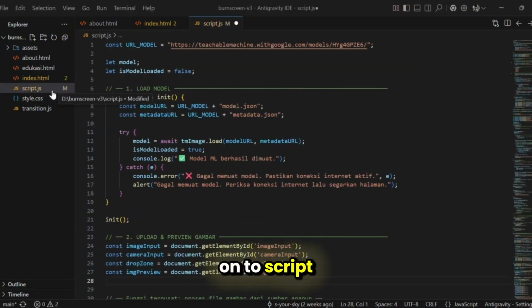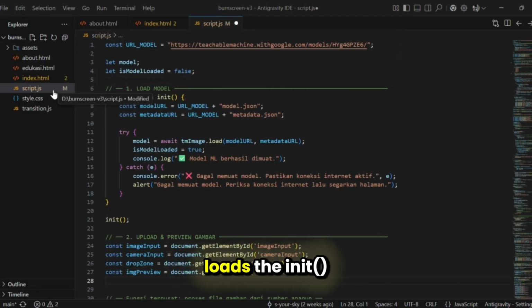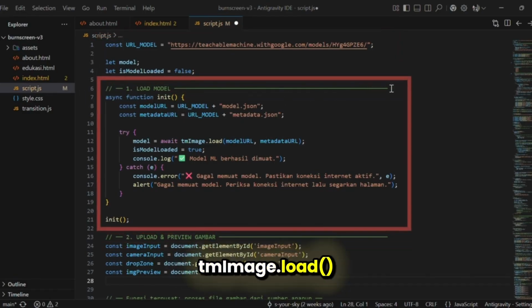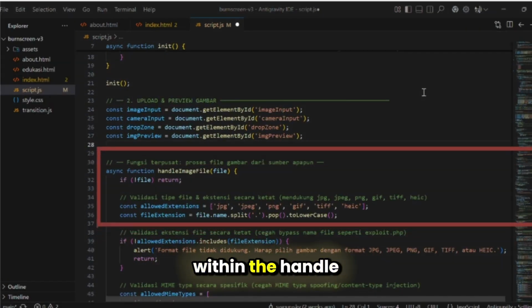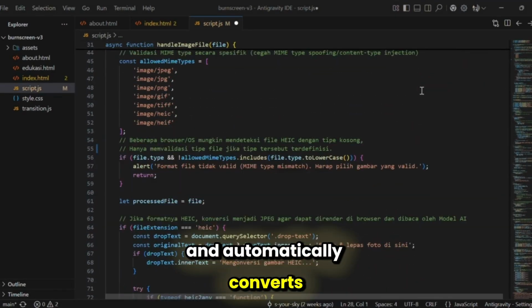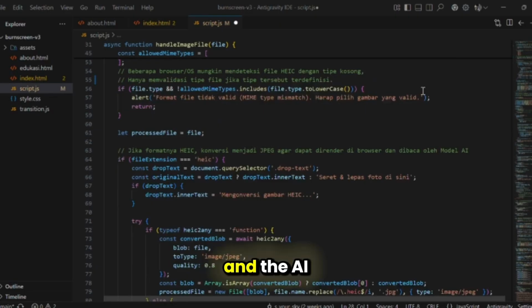Next, let's move on to script.js, which contains the core logic of the application. First, the program defines the URL of the machine learning model trained using Google Teachable Machine. When the page loads, the init function calls tmImage load to download and initialize both the model and its metadata, making it ready for image classification. The image upload workflow is centralized within the handleImageFile function. This function validates uploaded files, supports multiple image formats including JPG, PNG, and HEIC, and automatically converts HEIC images into JPEG format to ensure compatibility with web browsers and the AI model.